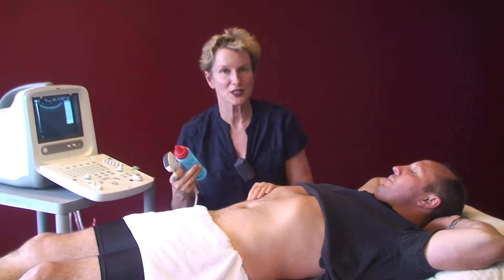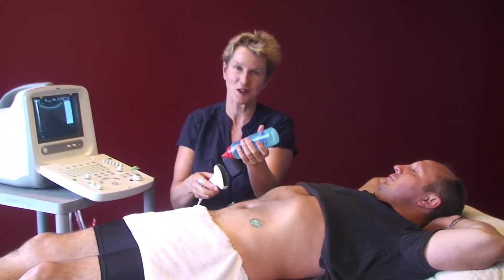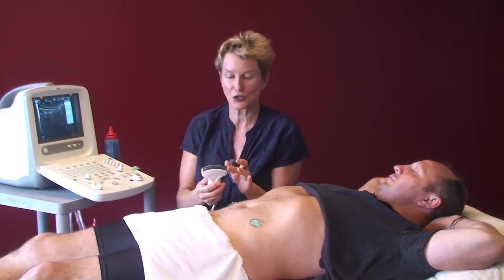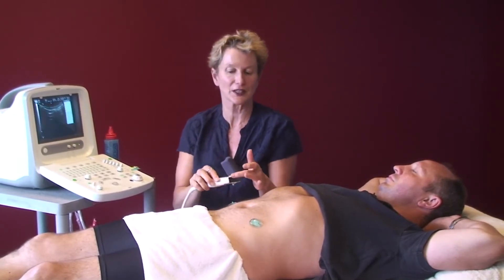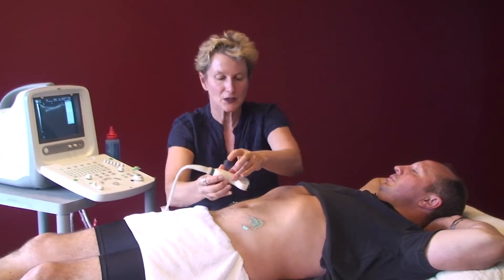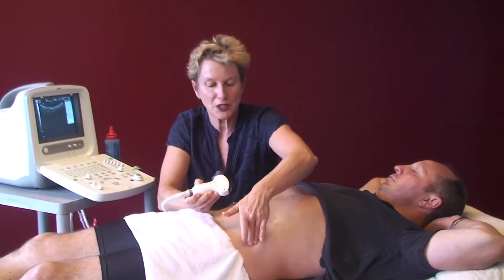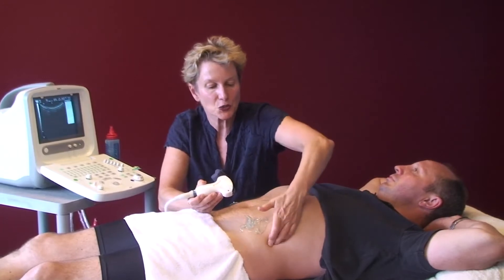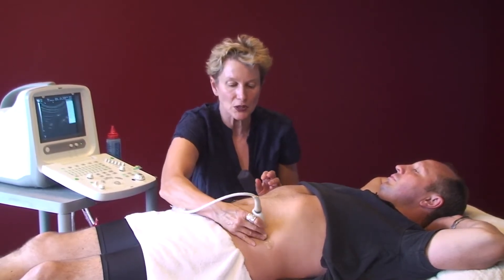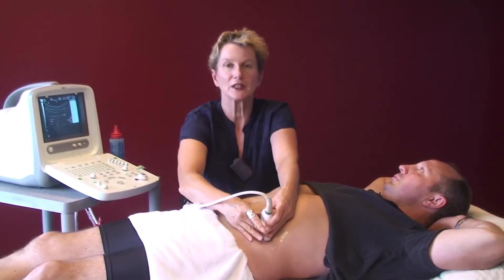Looking at where we're going to assess. Now, a lot of gel — don't be scared of putting too much on. Now positioning: I'm checking on the screen where I am so that the client can understand that. I'm looking for my dot. The best place we've found to be most reliable for looking at transverse abdominus is between the iliac crest and the bottom of the ribs. Come in on the side and across — right in that groove, into that position.